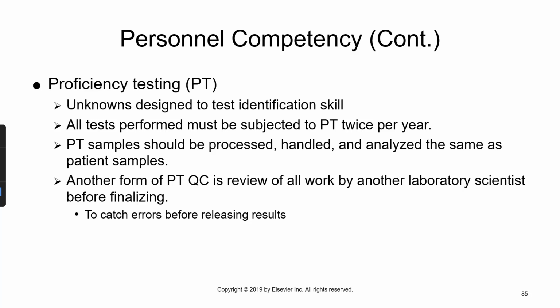You get all of the same resources that you would normally have. It's just you don't get the resource of another person. So you have to work this up on your own, given the resources and workflow charts and all the things that you would normally have working up a normal patient. All tests performed must be subject to PT twice per year. PT samples should be processed, handled, and analyzed the same as patient samples.